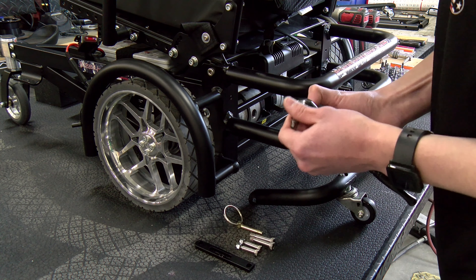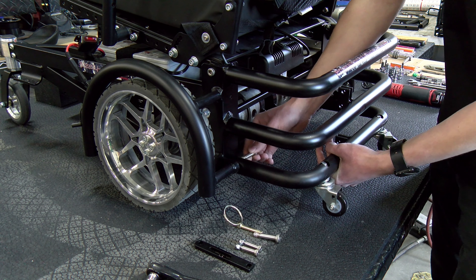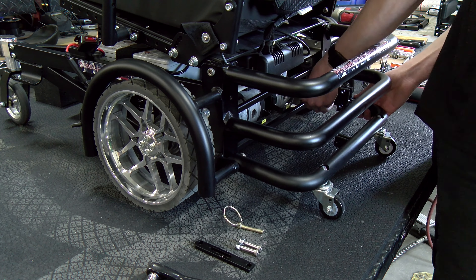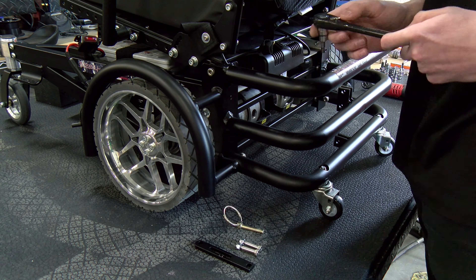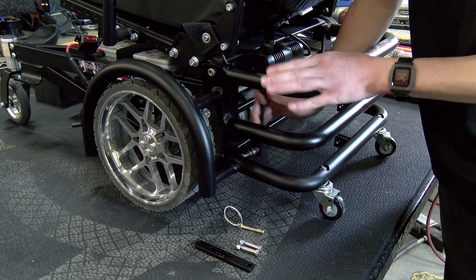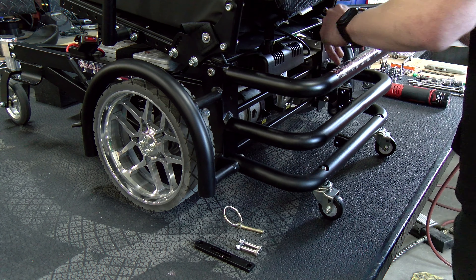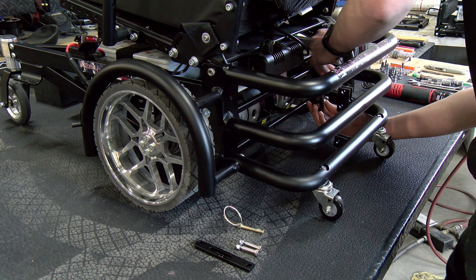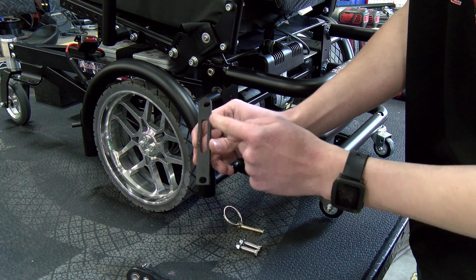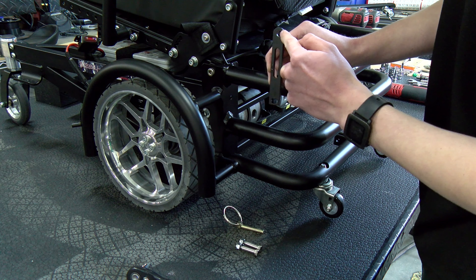Now that we have that reassembled, we can reattach it to the chair, starting with the two lower shoulder bolts. When reinstalling the tip bar linkage, the top hole is offset. As you can see, you want to make sure that this is pointing towards the back of the chair.